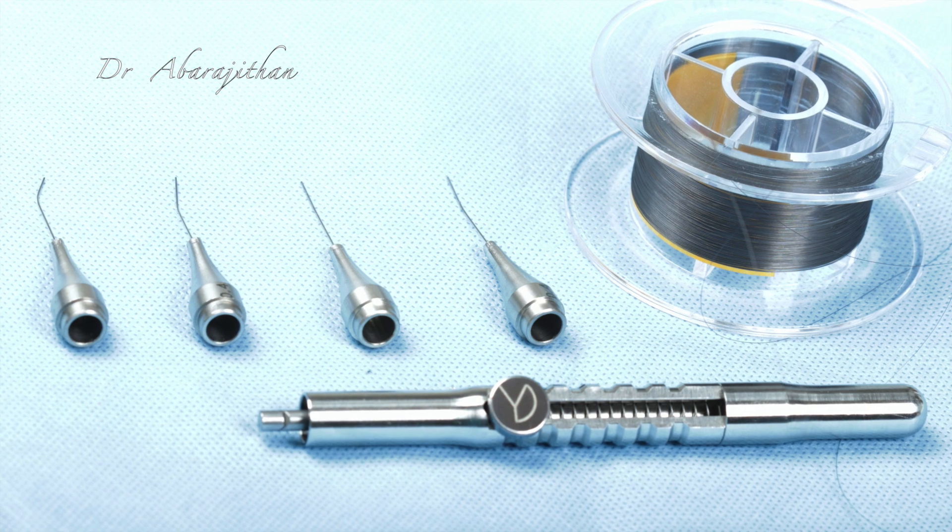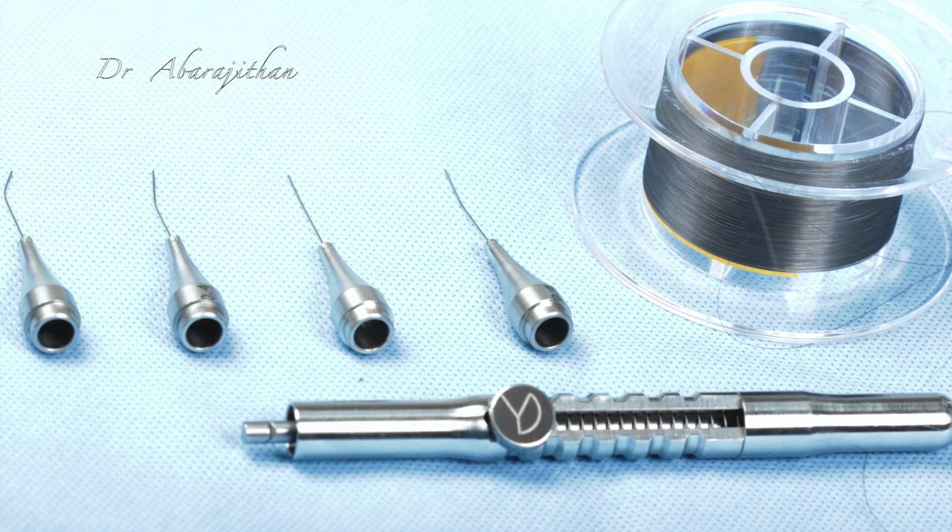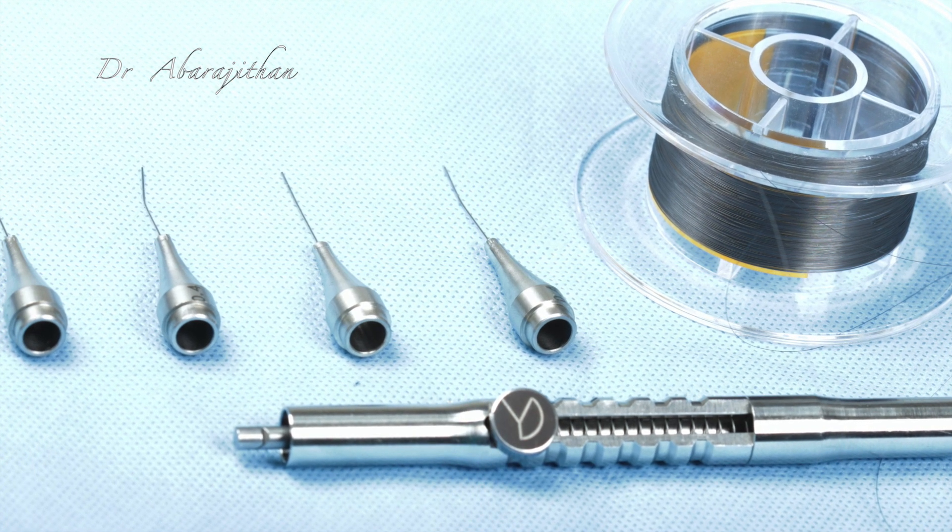The kit comes like this. There are four metal needles, an instrument retrieval cartridge, and a long wire which can be cut as per need.